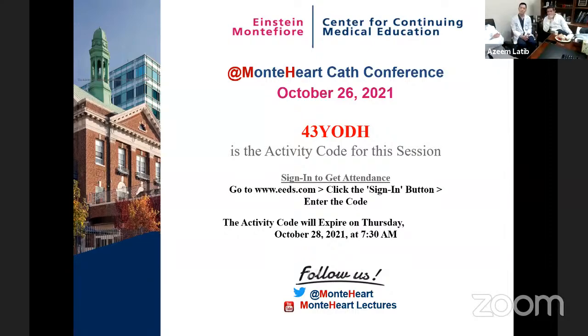Yeah, I mean, wasn't that the same reason that Edwards now in Europe are recommending for all their commercial cases to use ACE rather than PASCAL? Is the fact that sometimes you just can't get between the cords with the PASCAL, and with ACE you can. And so you end up curling, particularly the septal leaflet, rather than getting underneath it. 100%. Yeah, ACE is much easier to use than PASCAL in the tricuspid valve, for the average anatomy. Right. So maybe we need to start trying, because we've been kind of stuck on XTs, using mostly XTs for our tricuspids.